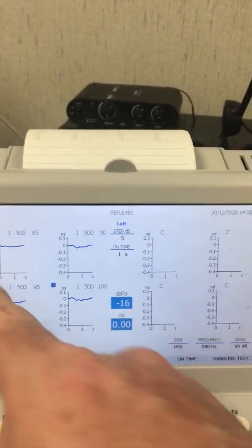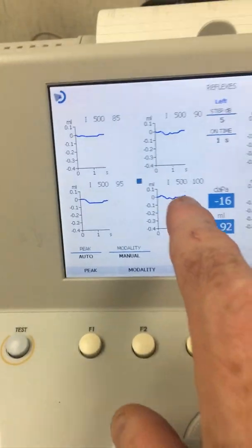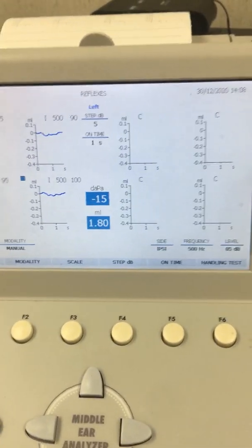So now you went from your steps 85 all the way up to 100. If you want to do it again just to do validity, you hit start stop again.